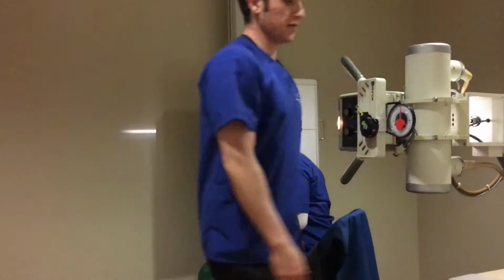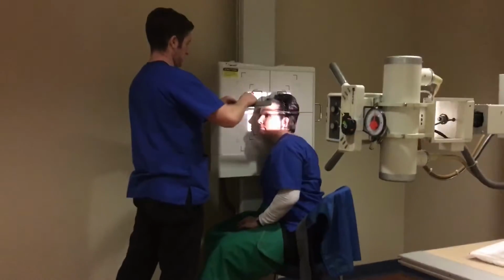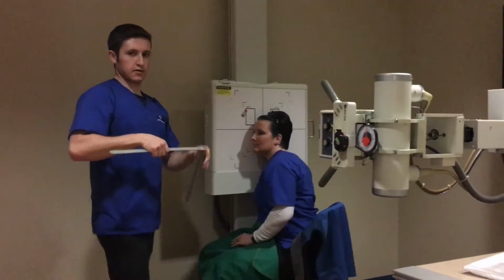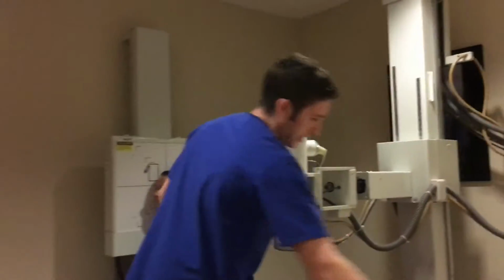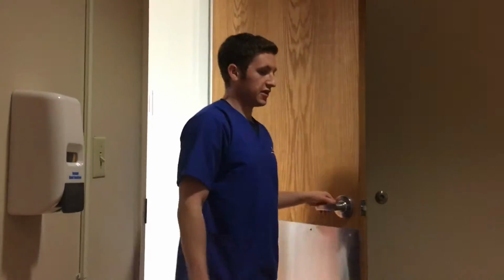I'm going to now measure my part. I want to measure right through the path of the central ray. I'm going to get 16 centimeters. Now ready to go set my technique on the control panel. I'm just going to shut the door behind me for radiation protection.